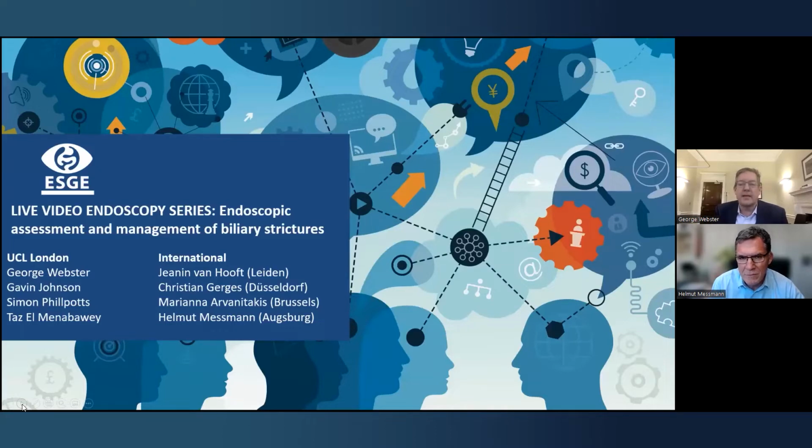We are delighted to be showing a few cases over the next 90 minutes to really inform discussion about a topic that we deal with every day of the week if we're involved in biliary disease, which is the assessment and management of biliary strictures. We are absolutely delighted to be joined by a fantastic international faculty, including Jeanin van Hooft from Leiden, Christian Gerges from Düsseldorf, Marianna Arvanitakis from Brussels, and Helmut Messmann, president of the ESGE from Augsburg. We're also going to inform the discussion by reminding us all about ESGE guidelines related to this important area.